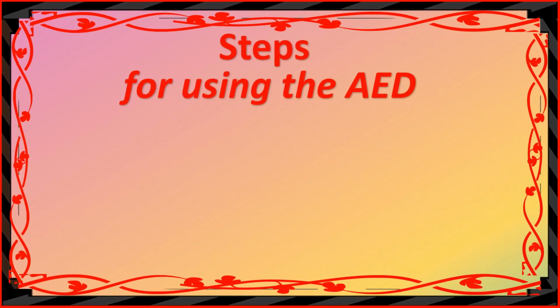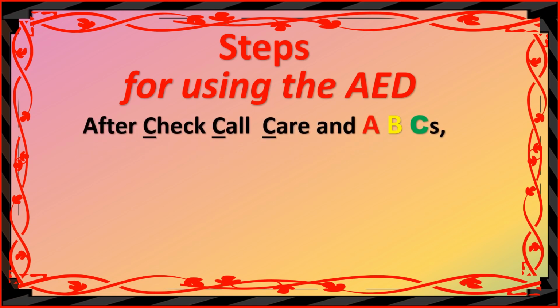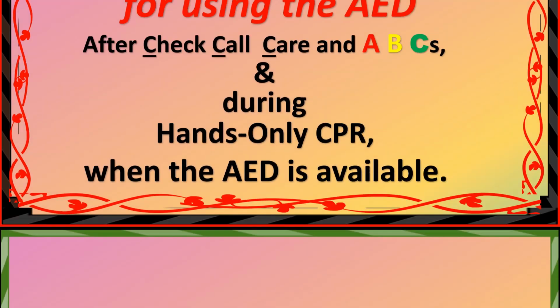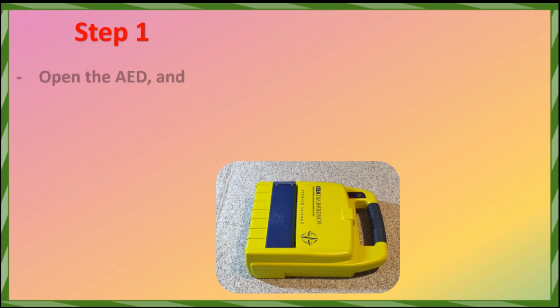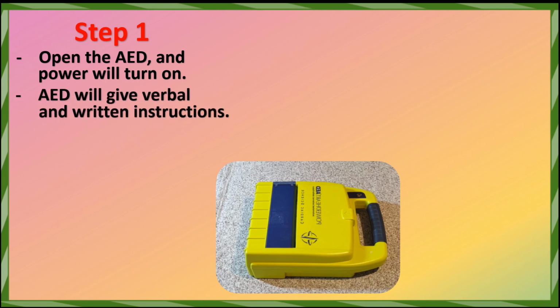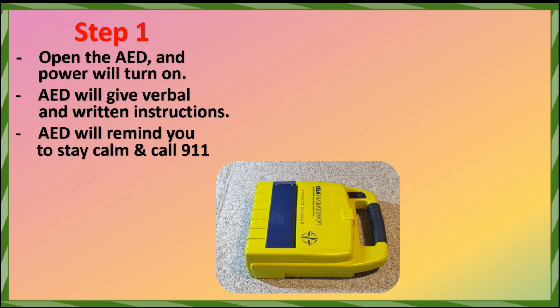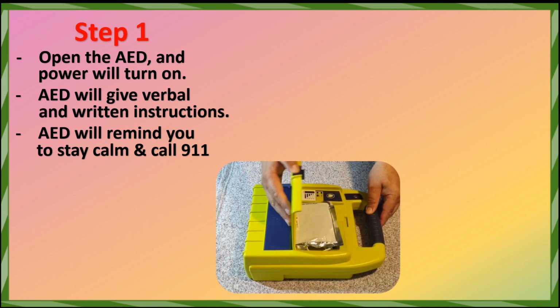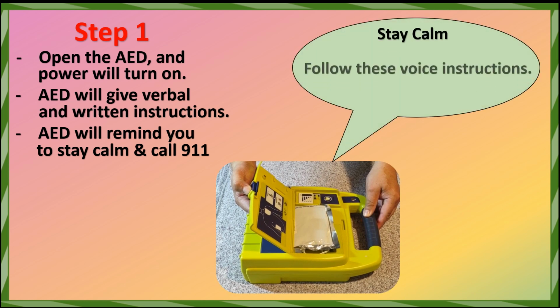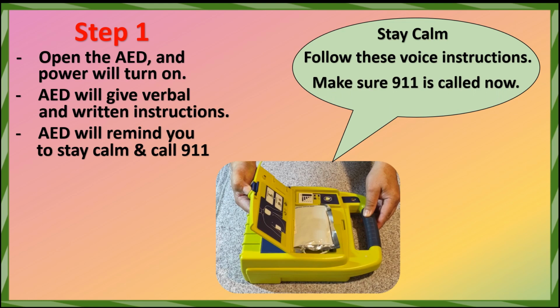Steps for using the AED. After check, call, care, and ABCs, and during hands-only CPR, when the AED is available: Step 1. Open the AED, and power will turn on. The AED will give verbal and written instructions. It will remind you to stay calm and call 911. Follow these voice instructions. Make sure 911 is called now.